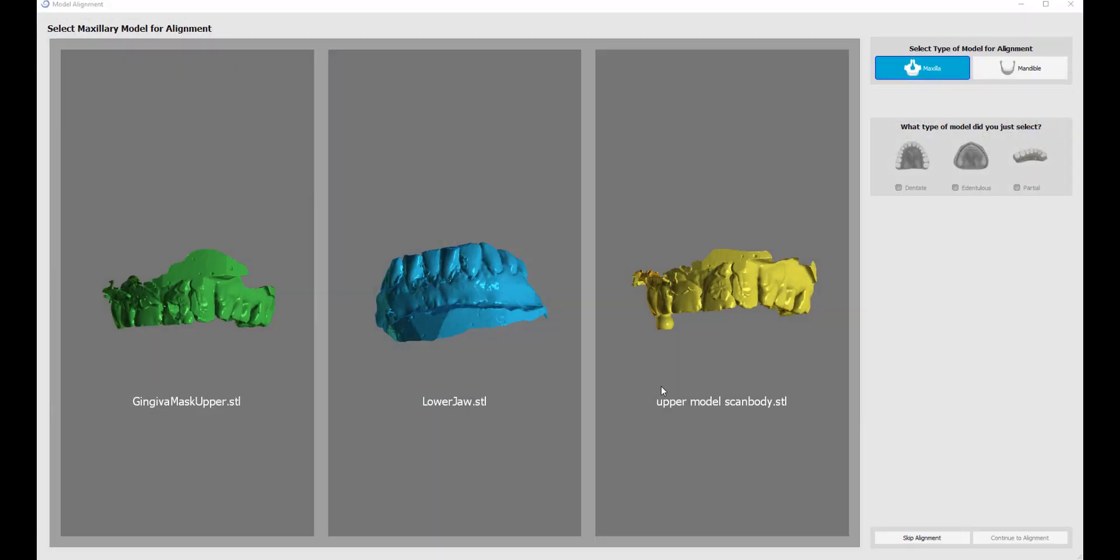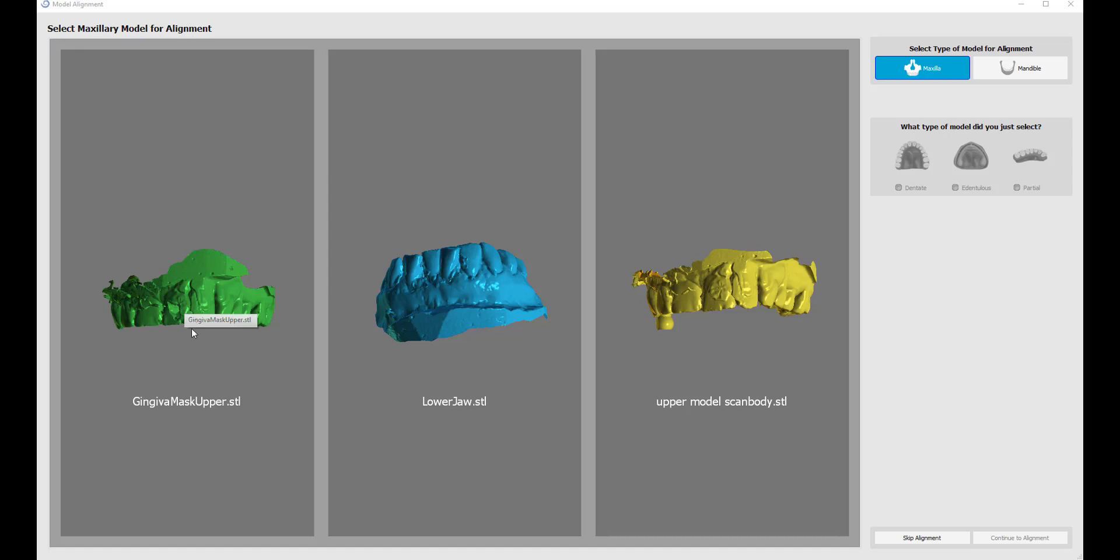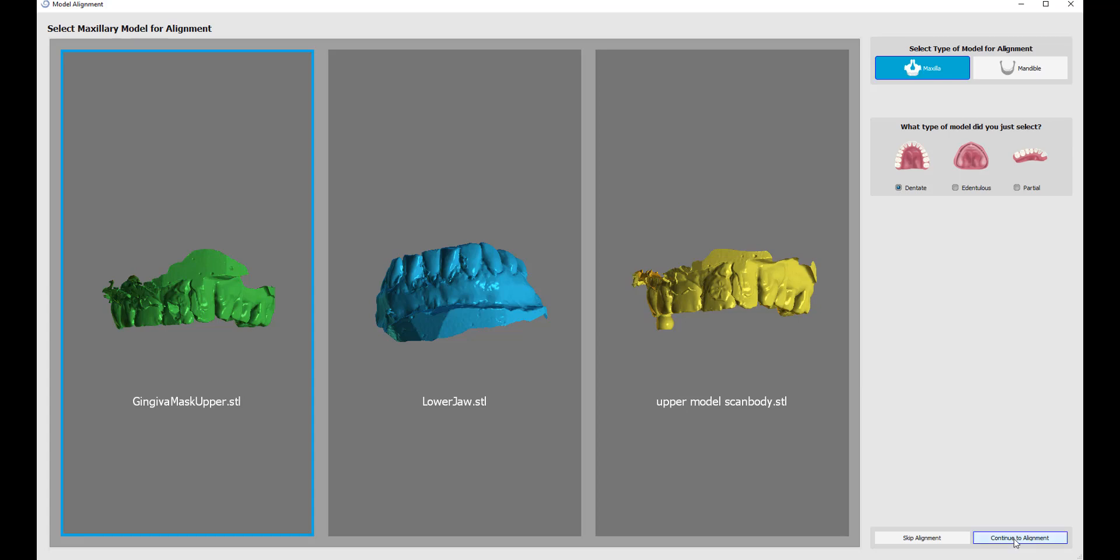We are now prompted to align the models and orient them correctly in space. Select the maxillary model for alignment. Assuming there is a maxillary model, you should go ahead and left click on it. Then confirm the jaw type, maxilla, and then select the relevant type of model, dentate, and continue to alignment.